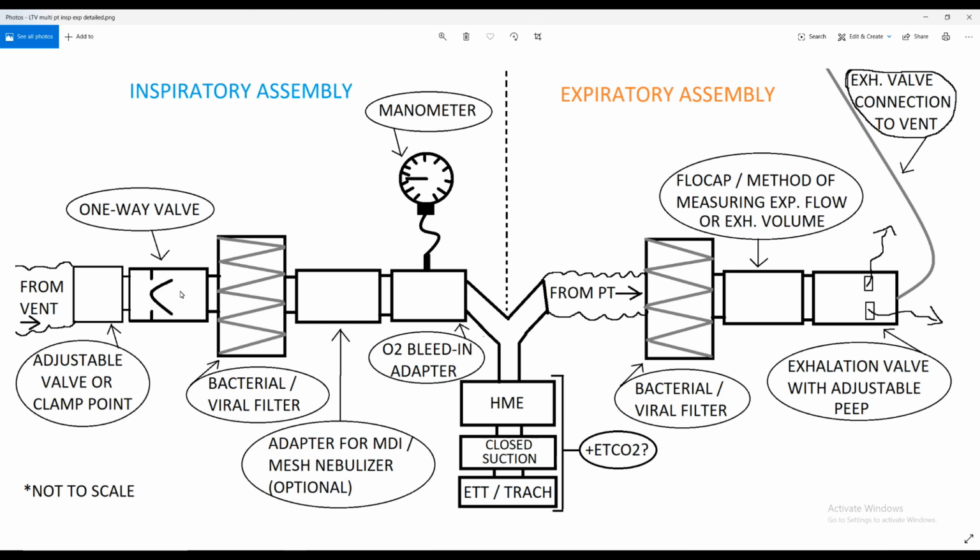So I'm not going to explain all of these different steps. I did that in the other video. None of this other stuff has changed. Like I said, the only thing I added was, if you have the capability of end-tidal monitoring, that would just be extra information that we're armed with so we can make better decisions. And the big game-changing part is adding the adjustable valve.